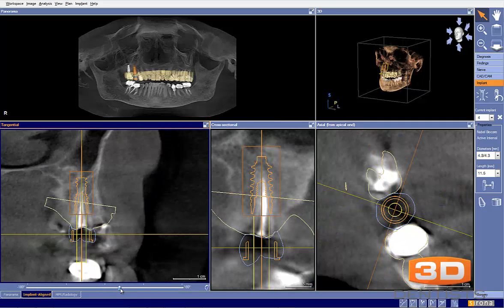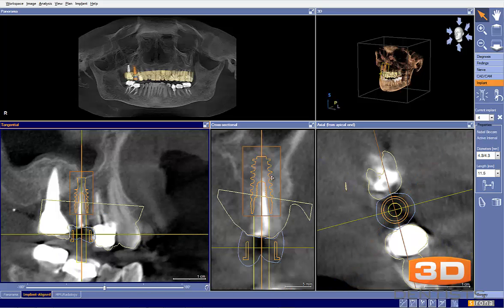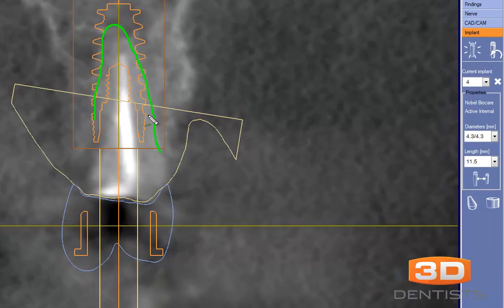One thing that we do need to take a look at, keep into consideration here, is whether or not we'll get any stability. So again, if I come back and draw a line for our tooth, once we extract the tooth, we need to evaluate how much of this implant is going to be in fresh bone to get us our stability.